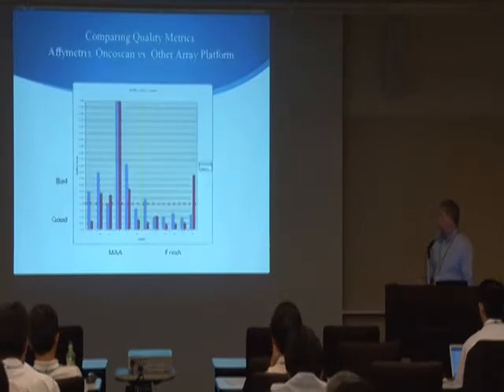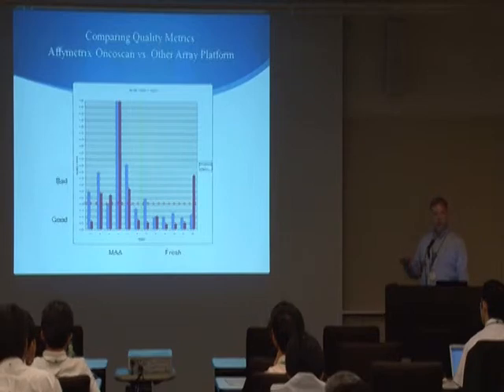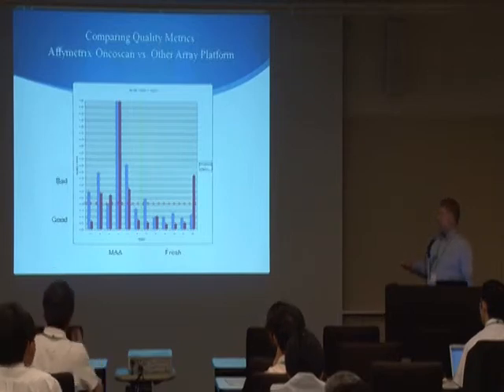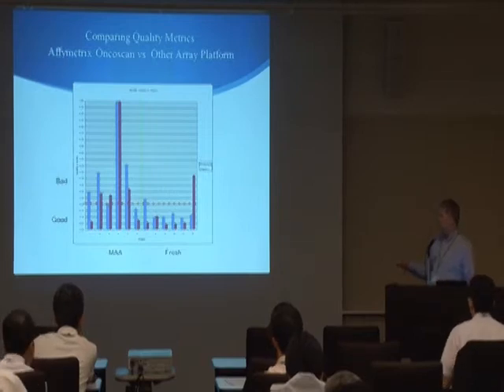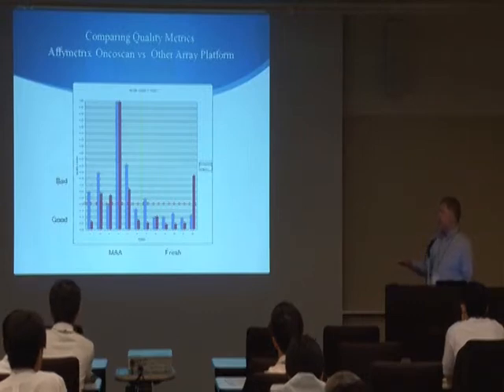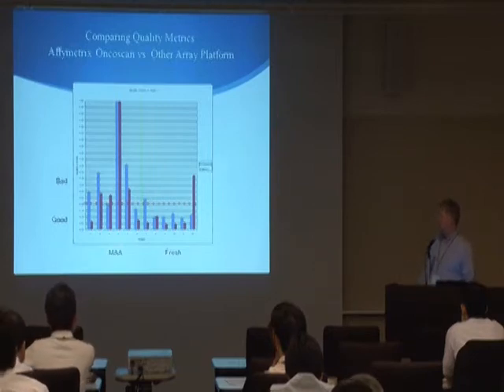And so the quality metric that the Biodiscovery software produces gives you an idea of what your sample quality is, and basically in the guidelines for the software, it's somewhere at around 0.22, which is this red dotted line here. They say under this value is a good quality specimen. And so we had taken several fresh specimens where a bone marrow sample had come into the laboratory, and we had extracted DNA from those immediately. And then we had several specimens that we had sent through for cytogenetic processing, so they had been cultured and then extracted and harvested with methanol acetic acid, which is what MAA stands for.